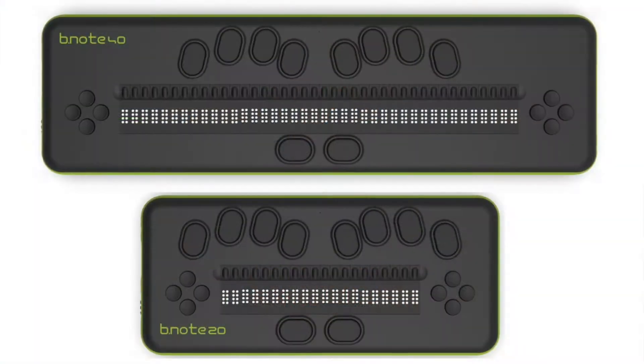Hello, this is the Eurobraille team. We would like to introduce to you our brand new Braille display called b.note. b.note is available in two versions: 20 cells and 40 cells.